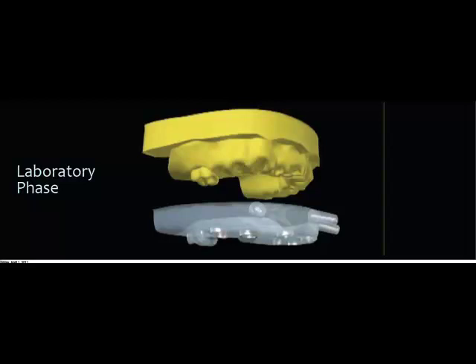Now we use the armamentarium developed by the manufacturers to seat analogs into our master model, kind of using an ultracast technique. So our analogs are all set into the model, and we position our abutments that we planned in the 3D plan, and then put in some conical cylinders. Those cylinders are placed, a cast framework is fabricated beforehand, and then the bridge is processed. You'll notice that the cylinders are not processed into the bridge.